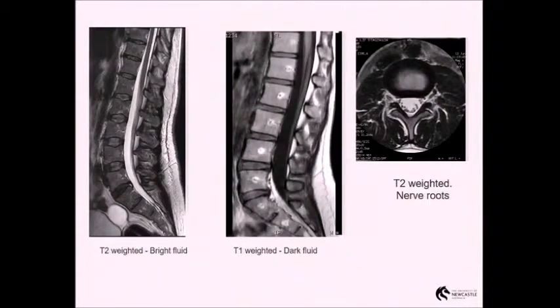And just a few more examples. Sagittal images of the spine. So this is CSF down around. So here's our spinal cord, this dark structure. So here we're looking at cauda equina. We're looking at conus medullaris and then cauda equina. So there's spinal cord, there's bright fluid. We can see the individual vertebra and we can see the intervertebral discs.